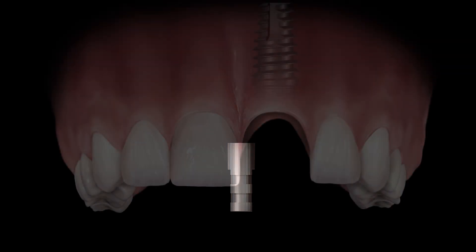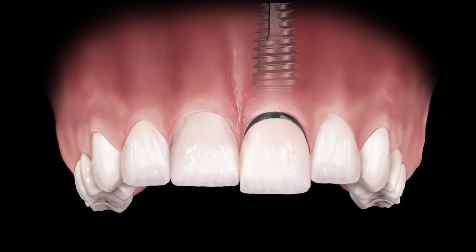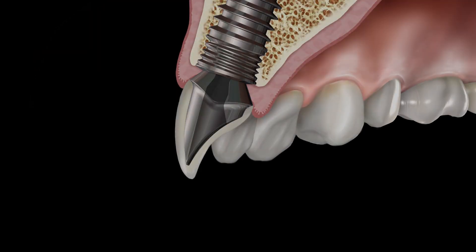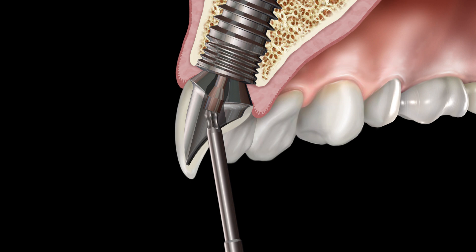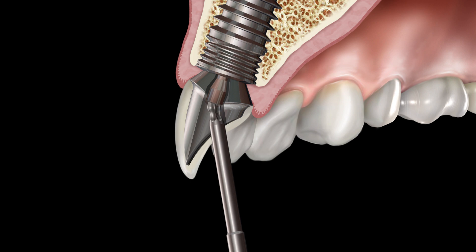Place the custom restoration in the mouth. Insert the fixation screw with an angled ball tip screwdriver. The screw should be torqued to 30 newton centimeters.